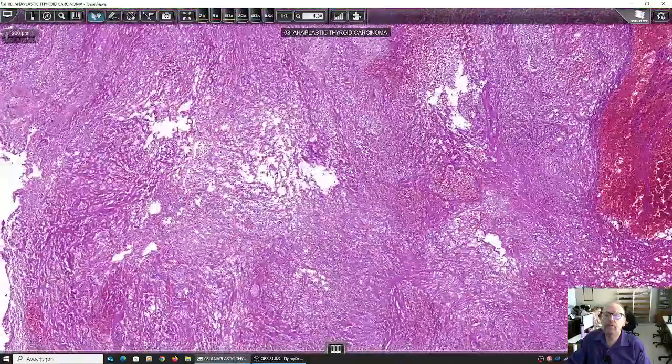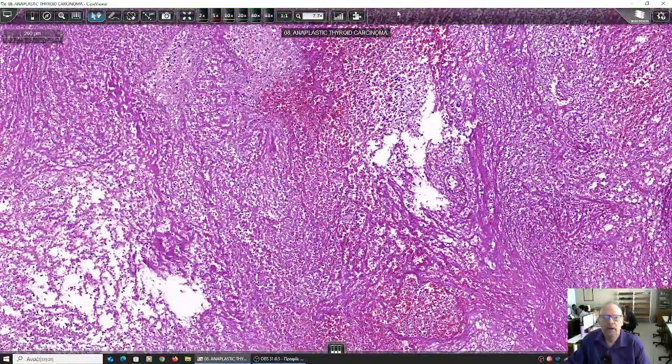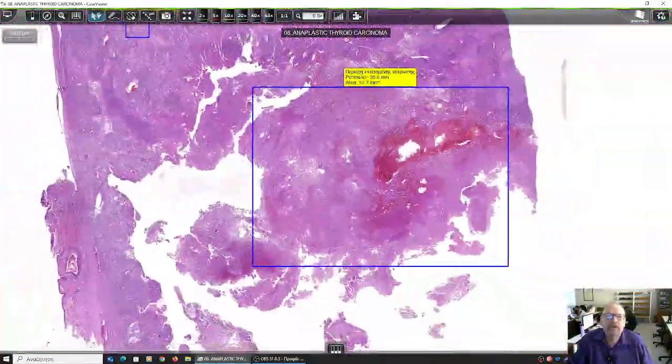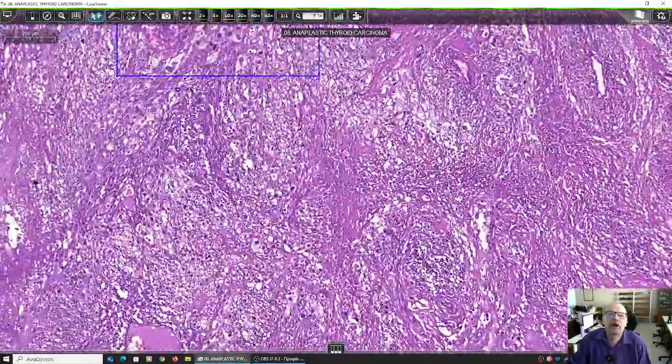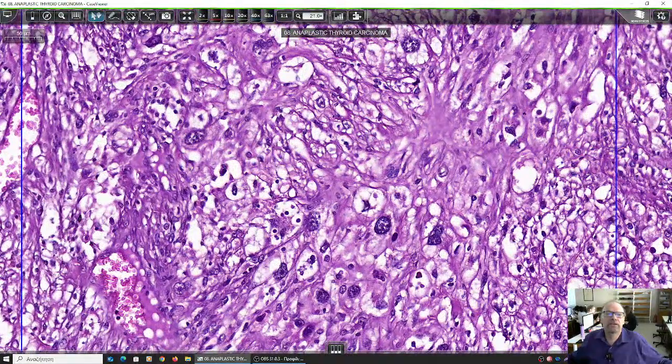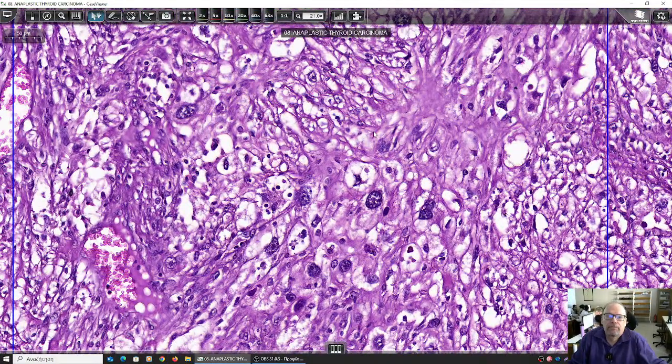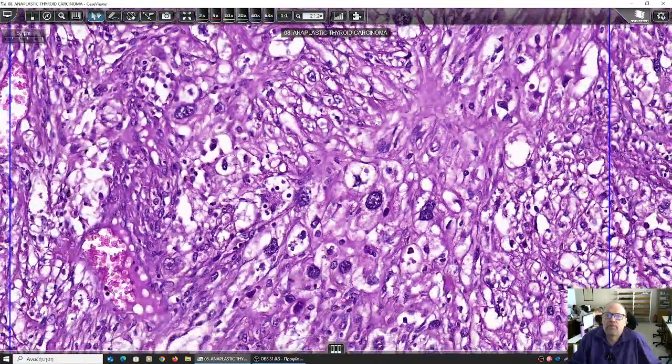This area here, can you define what has happened in this highly malignant, morphologically undifferentiated tumor? It's necrotic. A large amount of the tumor has become necrotic due to its increased biological aggressiveness. Have a look at this sign. What is the hallmark of high grade morphology? The nuclear pleomorphism. Look at the sizes and the shapes of the nuclei. This is a very increased degree of pleomorphism.